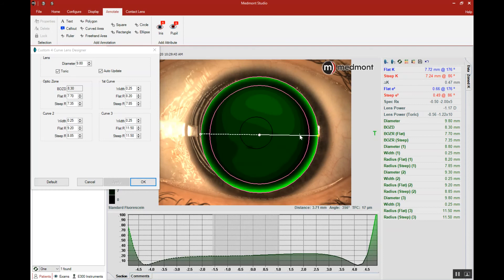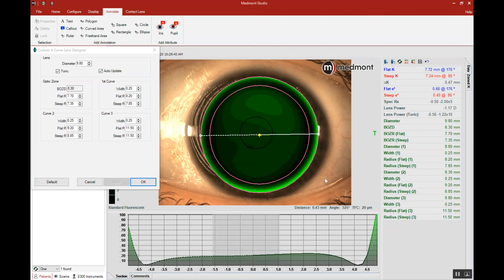We have our alignment across the horizontal that will keep the lens laterally stable. Having that appropriate apical clearance under the lens allows for the lens to land in the mid periphery and create a stable contact lens fit.